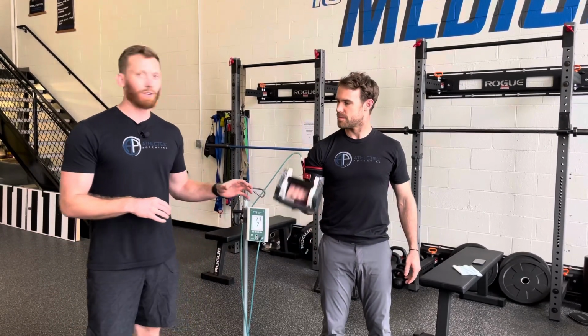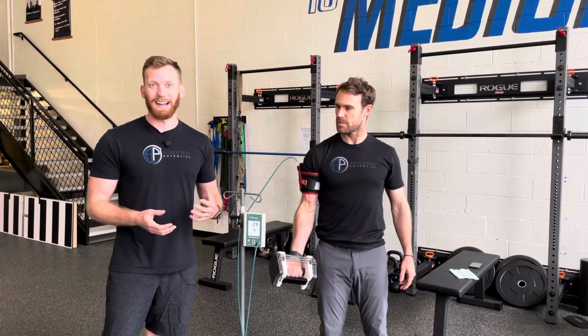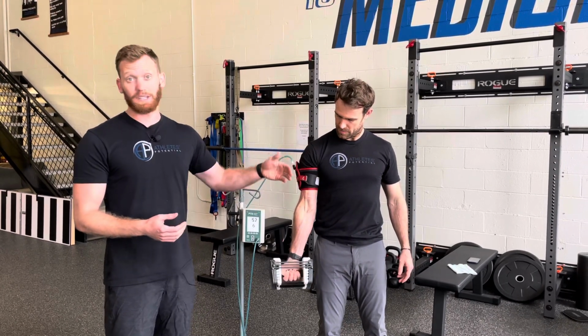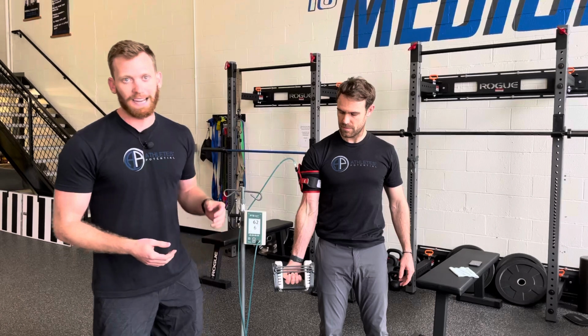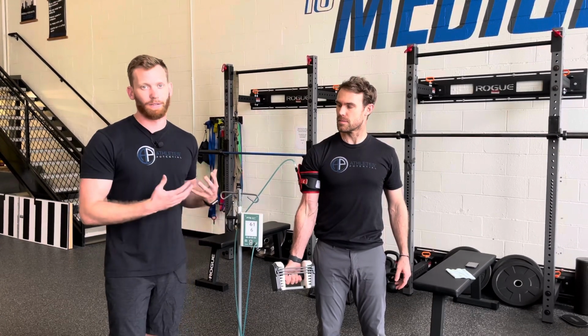BFR, what we're essentially doing is engineering suffering, right? It's like a biohack, and it's really cool what we can do and manipulate with blood flow restriction training. Essentially, we are restricting about 50% of Sam's blood flow going down into his arm. If it was his leg, it'd be about 80% of the blood flow going down to his leg. And then we restrict dang near 100% of that venous return, or all that blood flow trying to come out of his arm.